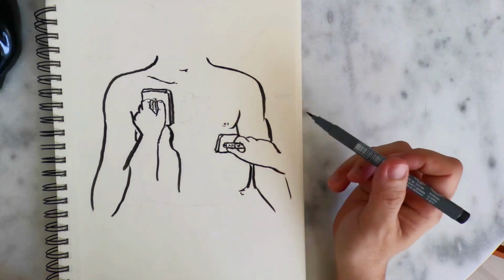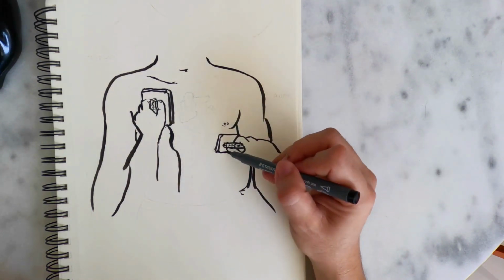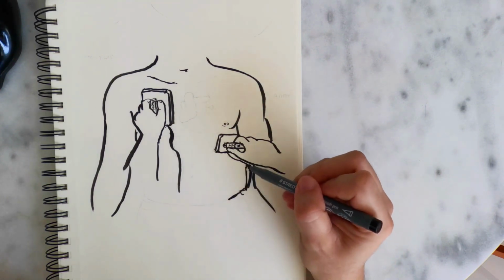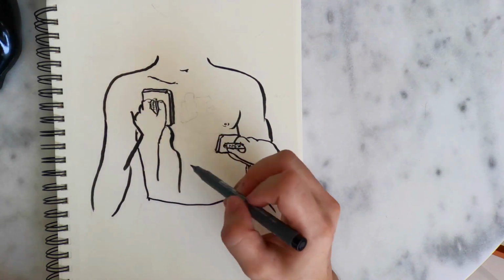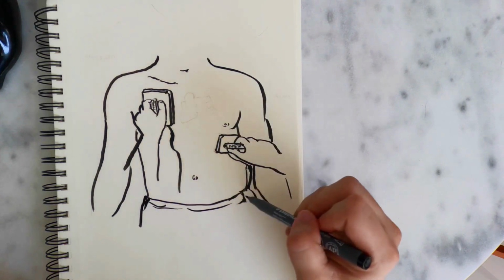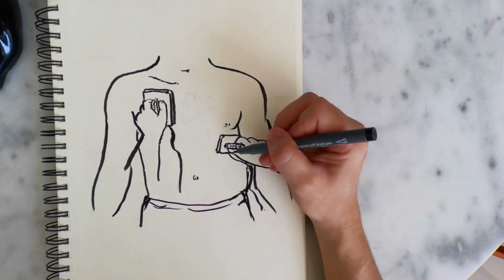In this scenario, let's assume the patient has a pacemaker or a heart stimulator located on the right side, and their heart has stopped beating. We need to perform CPR and may need to use electrical shocks. Can we place the pads directly over the pacemaker? The answer is no. If we place anything directly on it, it could damage the pacemaker because the electrical shock would affect it. Additionally, energy can be lost.